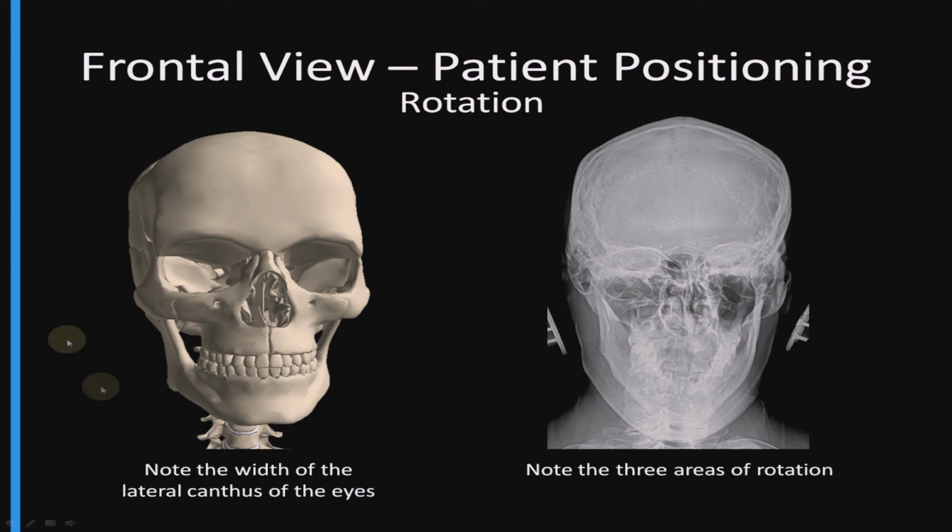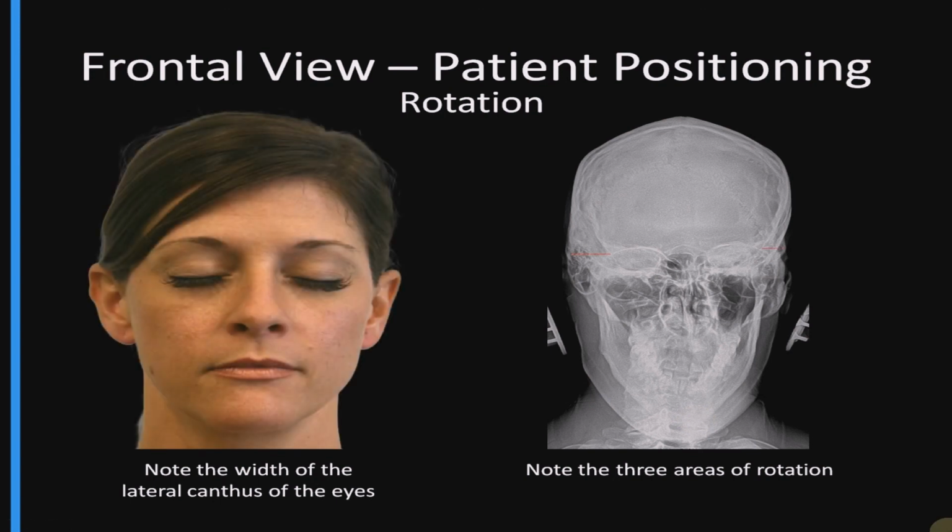So if you did your setup as well as you possibly could, and then you looked at the X-ray film and you saw this observation, where the widths were not symmetrical, if you observed the frontal bone more dense than the temporal bone, and this line coming down and joining the eye orbit, forming that little X right here and right here, and if the width from there to the side of the film was not symmetrical, you would realize from your film that the patient had rotation left in their positioning. And the distance would show up if we would have paid attention here.